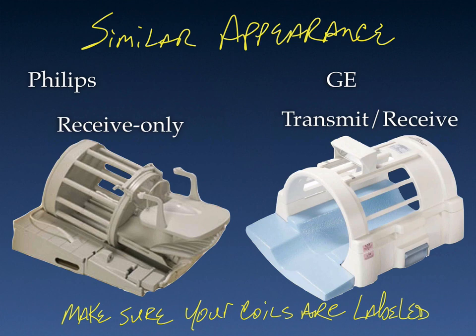So from an MR safety standpoint, it is very important to make sure that your coils are clearly labeled. As we'll see here shortly, some implants or devices have conditions of use that require a specific type of coil, for example, a transmit and receive head coil.